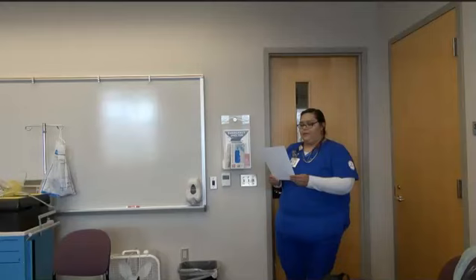Handheld nebulizer, also known as a small volume nebulizer. First, the respiratory therapist must obtain and review the physician's orders.